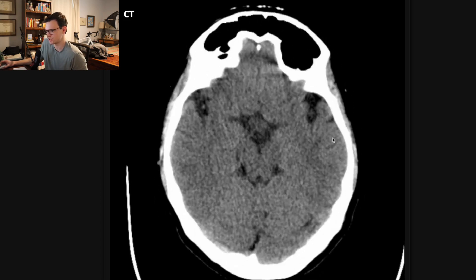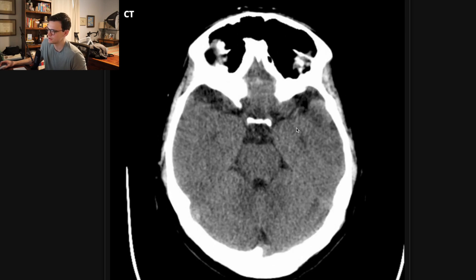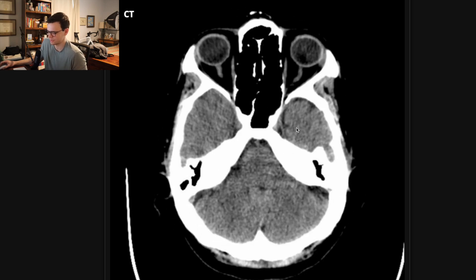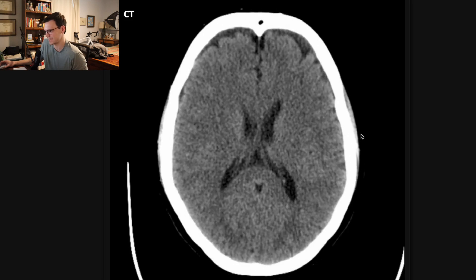On this normal head CT, the gray-white differentiation is maintained, there's not a dense middle cerebral artery, and there's not a loss of an insular ribbon sign — we'll get to all those things in just a second.